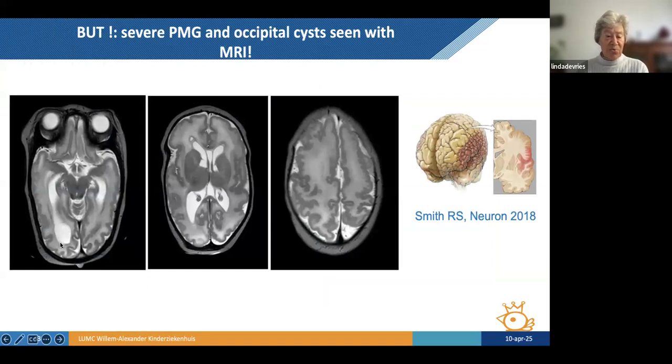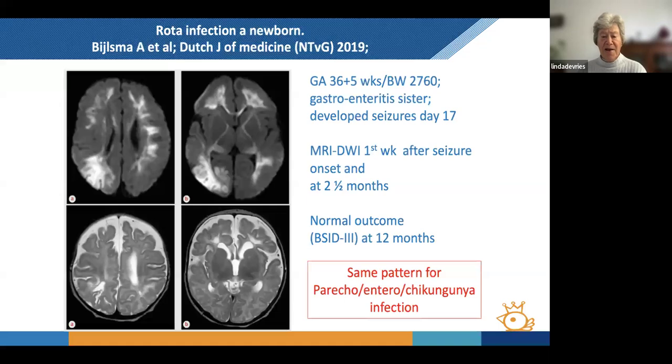on ultrasound. But what is most important, we see that the child has a lot of polymicrogyria. So you see these tiny little worm-like surface of the brain rather than the normal cortical infolding, which you still see anteriorly. And again, if you talk to parents when the child has just got some germinal cyst and LSV, then you will talk about a different future than when you see this very, very extensive polymicrogyria in this child. So for congenital CMV, if there are ultrasound abnormalities, please also perform an MRI.